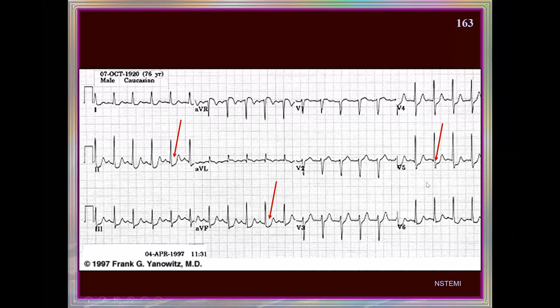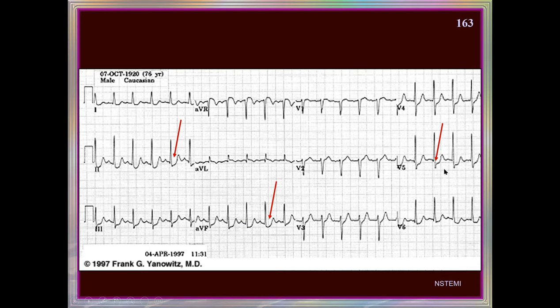The leads showing changes are the lateral leads and the inferior leads, so the part of the myocardium affected is likely the lateral and inferior — inferolateral. We are seeing ST segment depression, and this is non-ST segment elevation myocardial infarction, or non-ST segment elevation ischemic heart disease, or acute coronary syndrome. The two possibilities are unstable angina or non-ST segment NSTEMI.